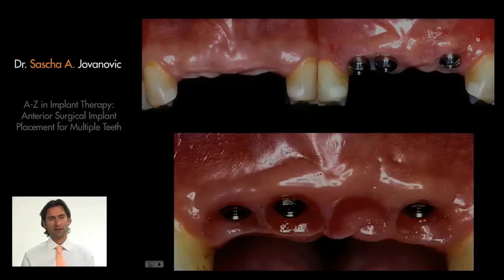And here you can see the creation of the pontic in the temporary ridge. And you can see actually how nicely we were able to demonstrate here this gingival papilla. So this is quite a beautiful result here for this patient. And we were able to recreate here this gingival papilla for the patient using an implant next to a pontic.